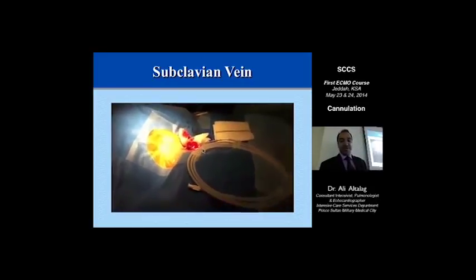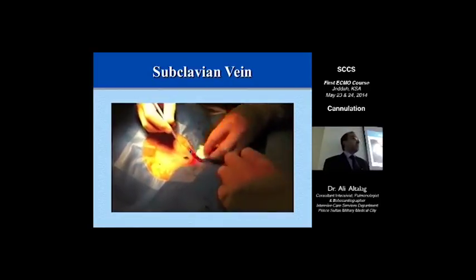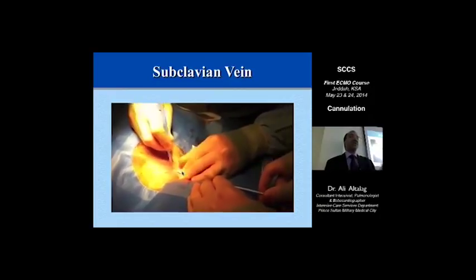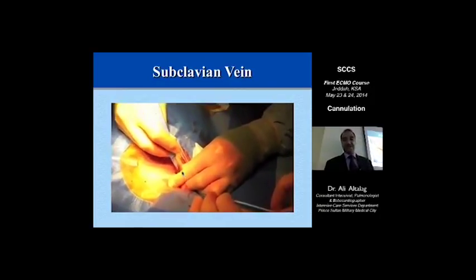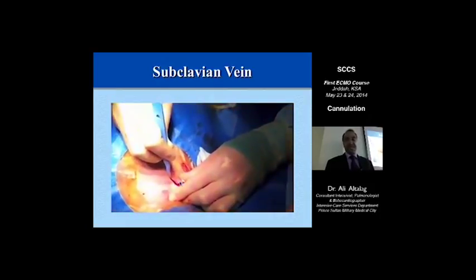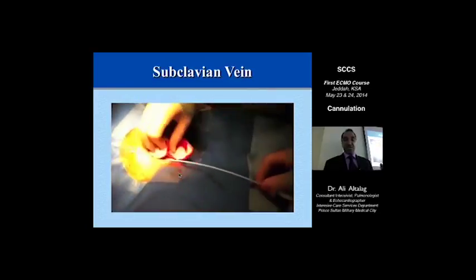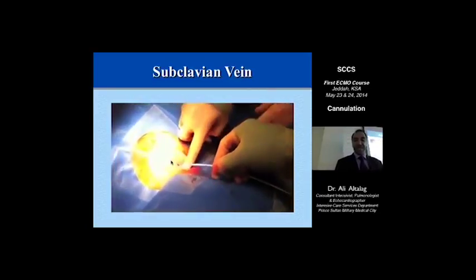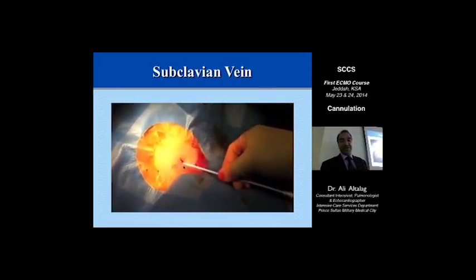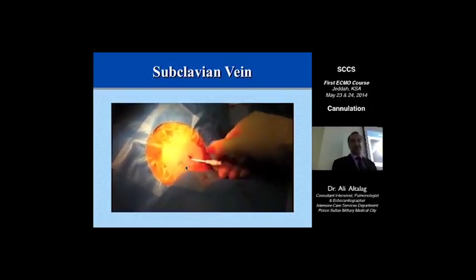So after you pass your guide wire correctly, you make a reasonably big and deep incision. Not that big, but with cut down, probably it's okay to make it very big. So this is again the percutaneous technique. We are not talking about the surgical cut down. Make sure that the hole you are making is well dilated with the forceps, and then pass your first small dilator. Okay, go in. It's better to lubricate your dilators as well, because this will help.